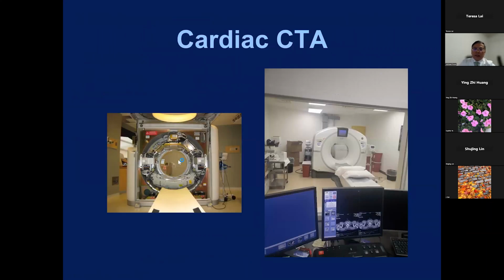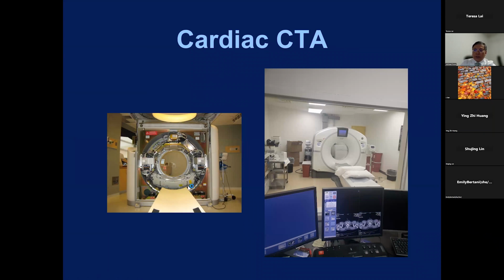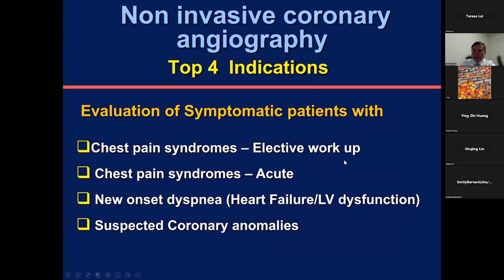If you look at a CAT scan, this is a CT scan, and you open up the hood, so to speak, you see an X-ray source and you see the detector row on the other side, and the patient goes through the middle part of the gantry, sort of the donut hole. The X-ray rotates at a very high speed, and with the high-resolution detector, you'll be able to see the structure of interest very, very accurately. The picture on the right is the scanner that we currently have in Brooklyn. So it's doing a lot of good work for us every day.